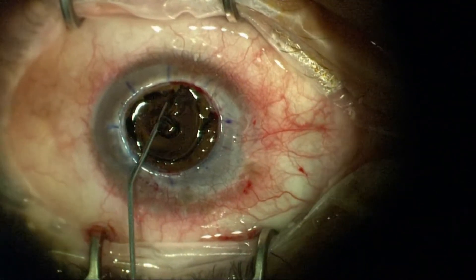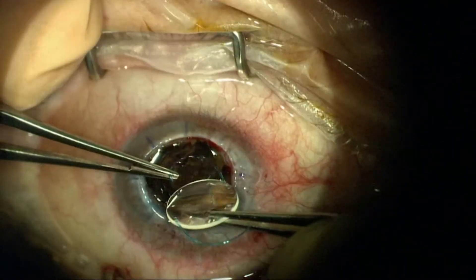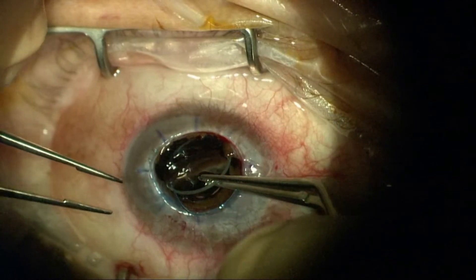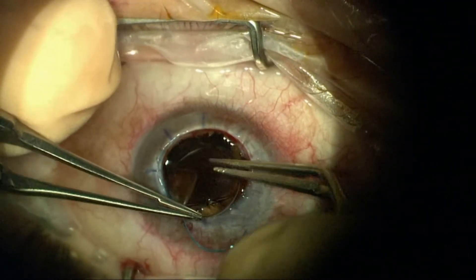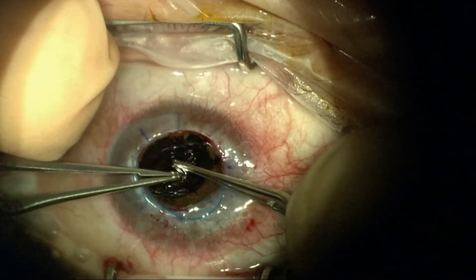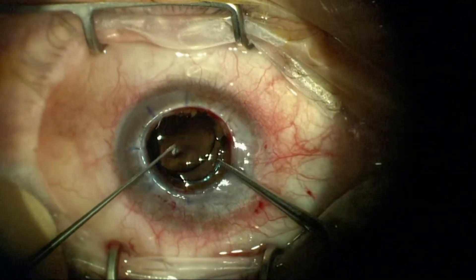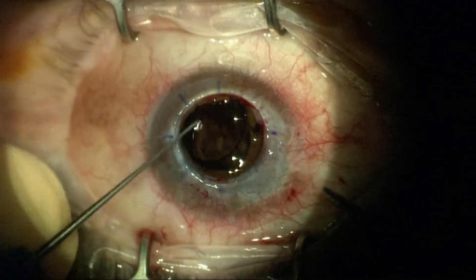In a closed system, viscoelastic would be used to open up the capsular bag; in an open sky system like this, it's predominantly a lubricant used to get this three-piece lens in. The one-piece acrylic 'gumby style' lens wouldn't be as well suited in this situation — it'd be a little harder to get in and keep in. The three-piece lens works a little bit better in this open sky scenario. Very careful here to put this in without causing an extension or tear out into the periphery of the anterior capsule.